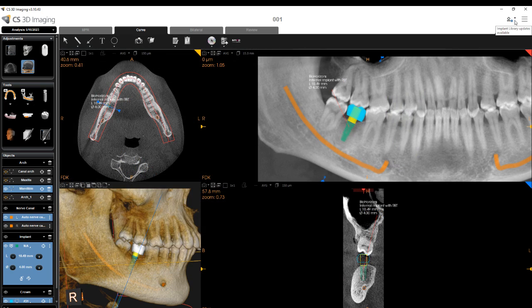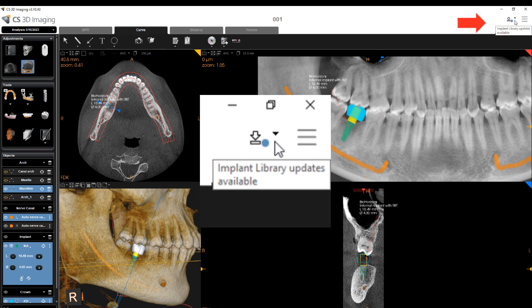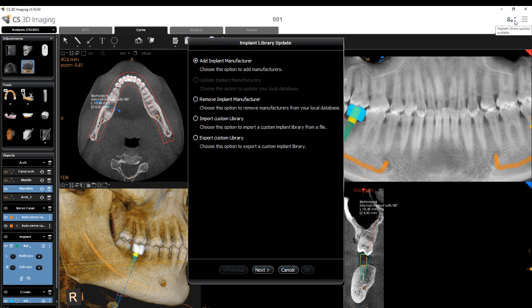When updates are available, a blue dot update icon appears in the CS3D Imaging main toolbar. To update the implant library, verify that the computer is connected to the internet. Click the update icon. The implant library update window appears. The options are to add an implant manufacturer, update the implant manufacturers, and remove an implant manufacturer.